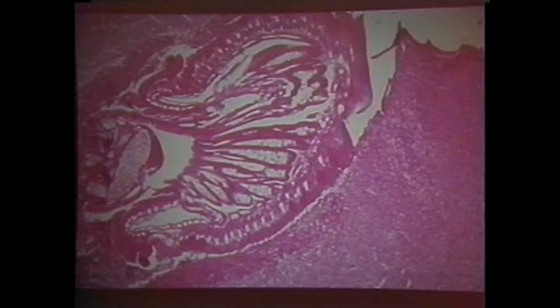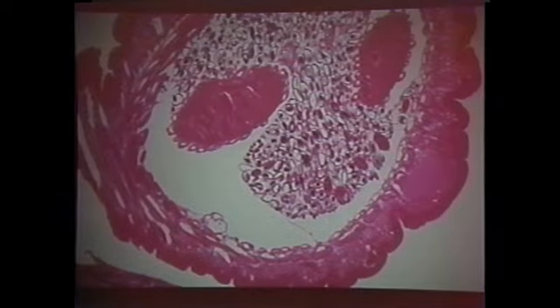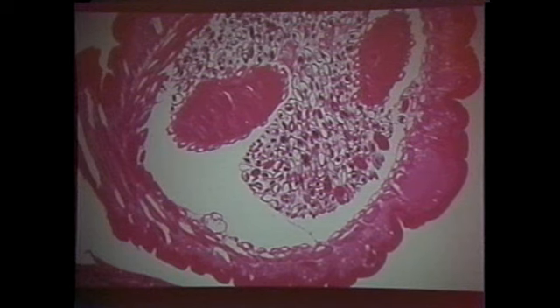These are the Acanthocephalans. Now, most everybody gets the diagnosis when you have an anterior end embedded in the intestine that has hooks. You see these things right here? I mean, it's not often that you miss that diagnosis. However, when you have a section of the acanthocephalan in the intestine, sometimes people who don't know the morphological features will miss it. But acanthocephalans have something that nobody else has, and that's called lemnisci.